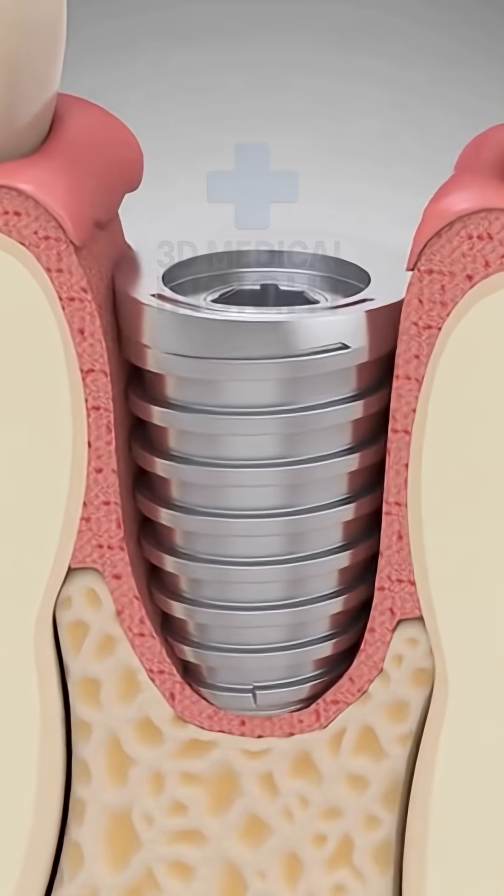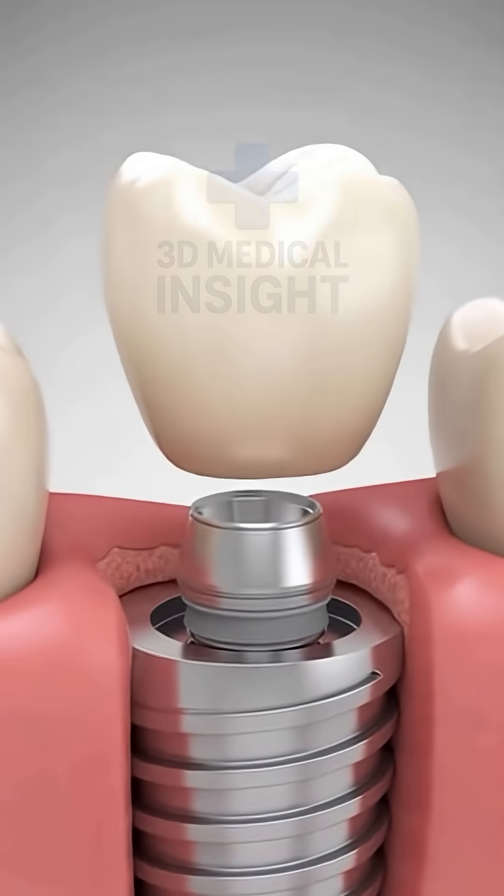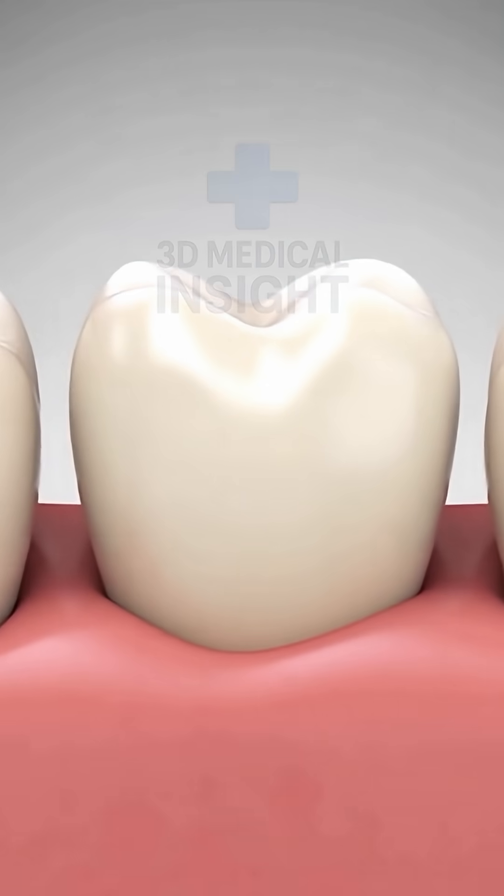After healing, an abutment and custom crown are placed on the implant. The tooth is restored, looking and working like a natural one.